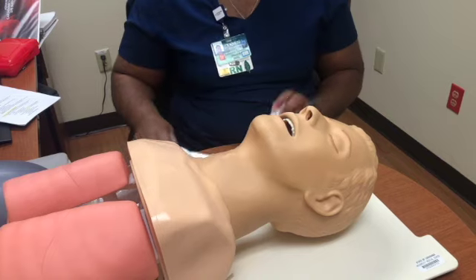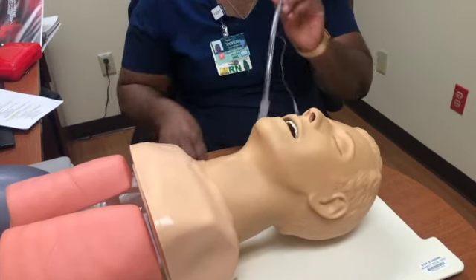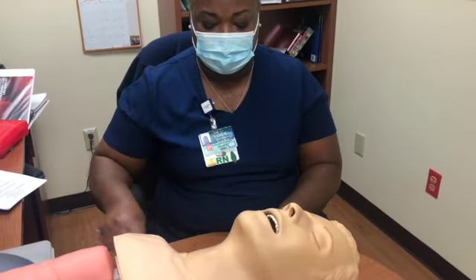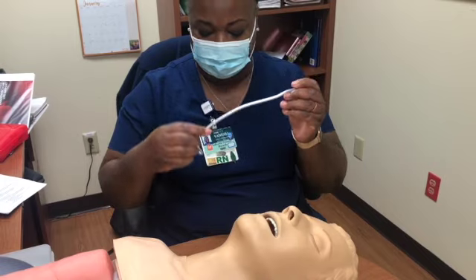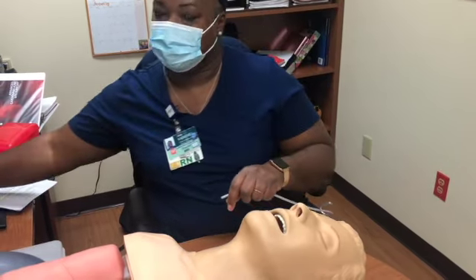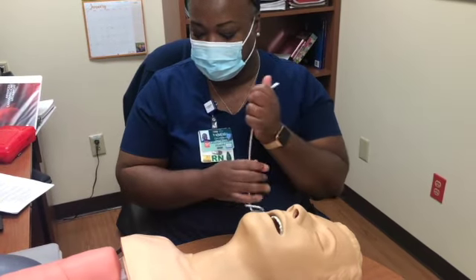When you're assisting with intubation, you would need to gather some supplies. You would need an ET tube. The physician will tell you the size. You'll need a stylet, 10 cc syringe, CO2 detector, and some lubrication.